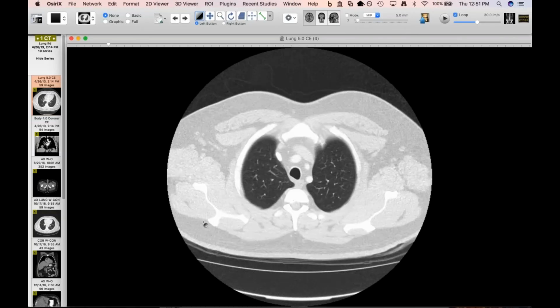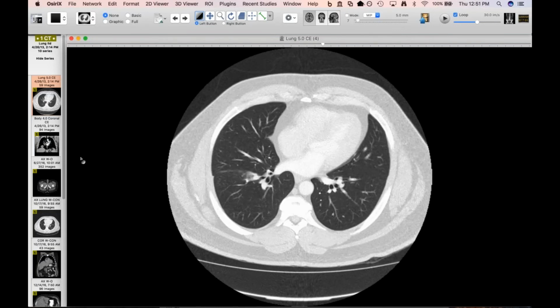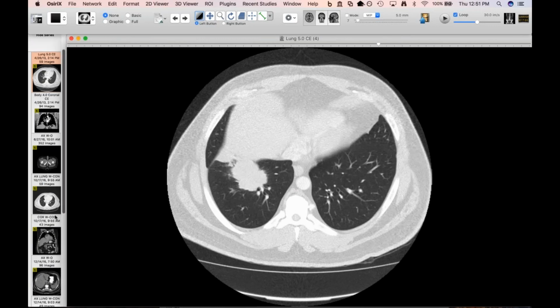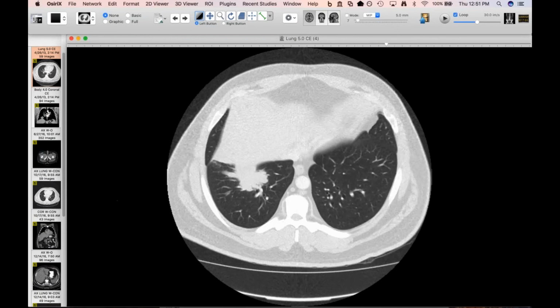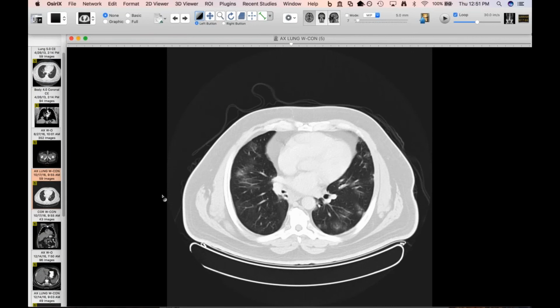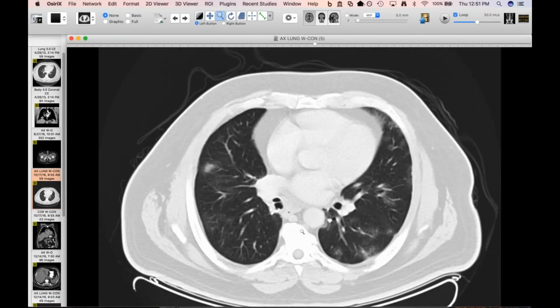So this is an interesting one, and this is a patient who has stage 4 colon cancer, and this was from 2013, so a few years ago. I think this was a metastasis at the time, and I don't remember. It's not really pertinent to this, but anyway, he looks okay in 2013. He did okay after this until 2016. He ended up with a different treatment starting at some point during 2016, and he presented with this back in October to an outside hospital.